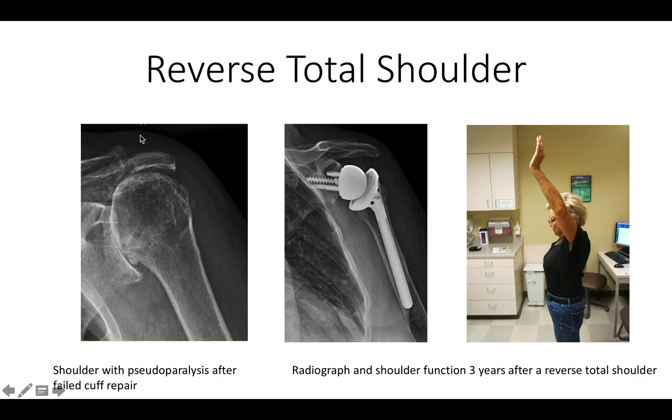Here's an example of a shoulder that had pseudoparalysis after a failed rotator cuff repair — meaning the patient was unable to raise the arm above the horizontal. In spite of an active aggressive rehab program, the patient still had pseudoparalysis. You can see that the humerus had moved up and in.